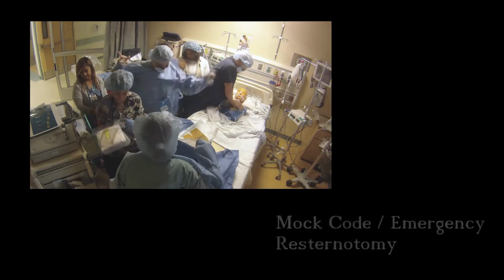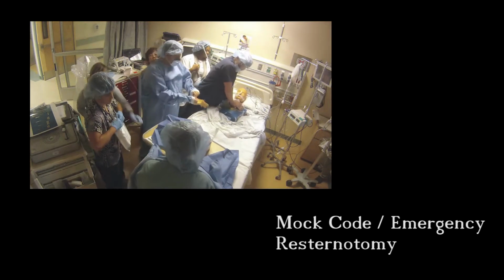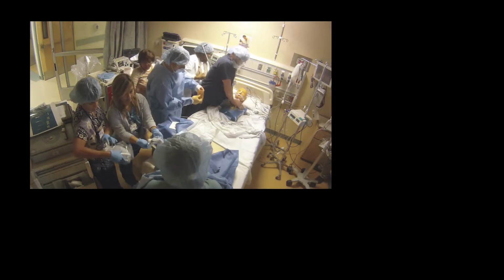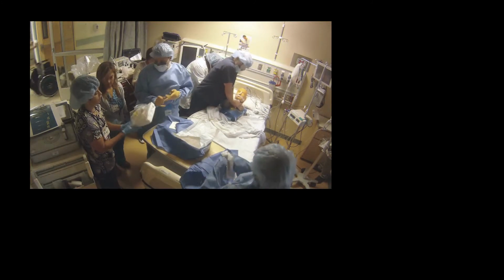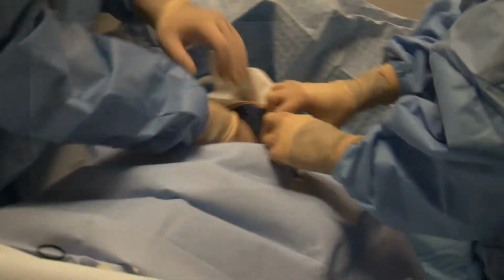In low-volume ICUs, where this procedure is performed only 1 or 2 times per year, realistic mock codes are imperative for training the staff. Assessing team competence in performing this procedure requires a realistic simulation mannequin and a tool to measure team performance. The mannequin needs to allow the team to perform the actual steps of the procedure, including removing sternal wires and use of a retractor to expose the heart to perform internal defibrillation or direct heart massage.